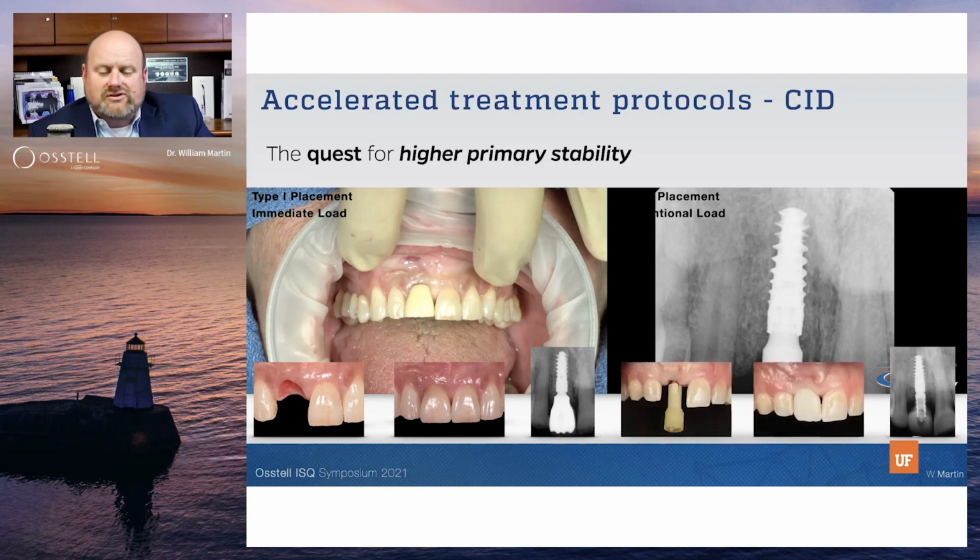We captured the tissues. And here in this situation, we had a healed site that now had an implant placed that had a graft placed over it. So we're going to let this patient heal for a longer period of time and then uncover and load that patient at the uncovery visit, once we've done an Osstell to confirm that we're happy with the stability of that implant.